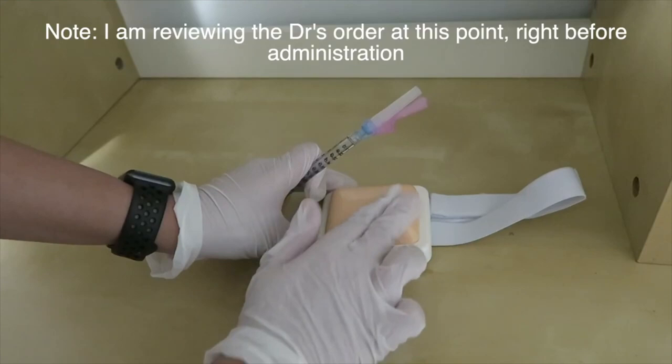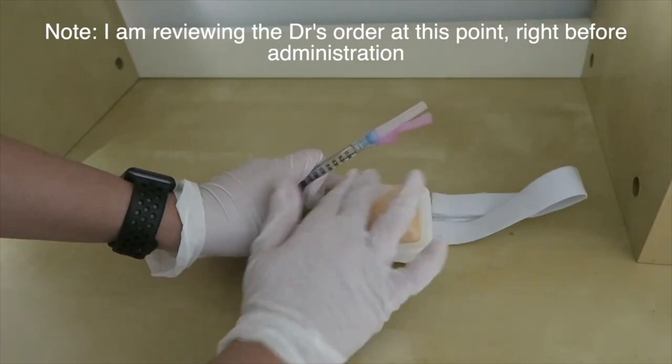So now, taking an alcohol swab, I'm going to clean the surface of the site where I will be administering the injection. Making sure that I get all the surface.